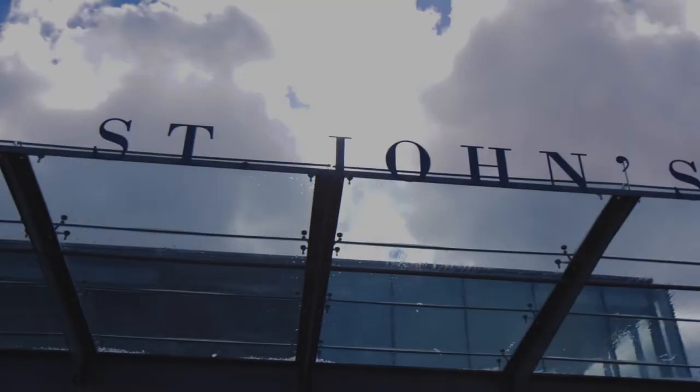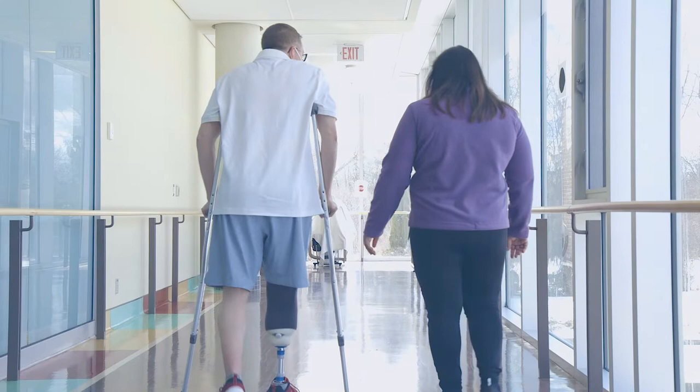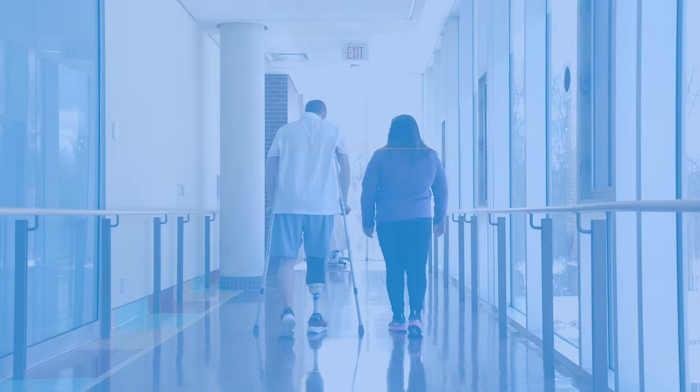Your residual leg will vary in shape and size after your amputation. These changes will affect the fit of your prosthesis. You can manage this by following some of these tips.